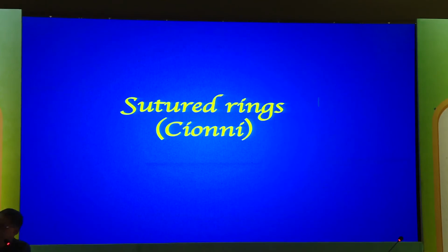If anybody has any question, he showed those traumatic ones that you meet in everyday practice, and especially on the table you suddenly find that lens, and how to go about it, very useful tips. I think you didn't cover that, when you suddenly have caught some part of it. I think that's again the CTRs that would help. Dr. Minu, please continue sitting there in the panel.